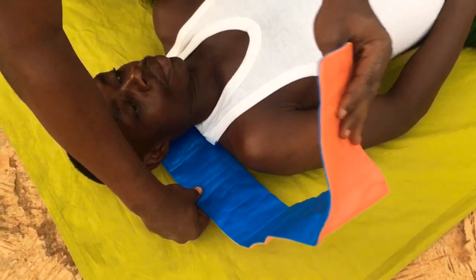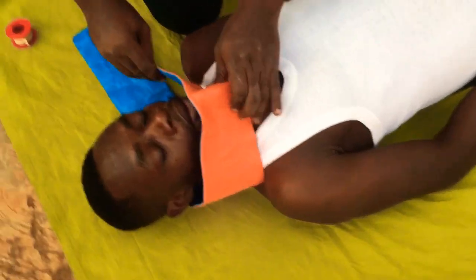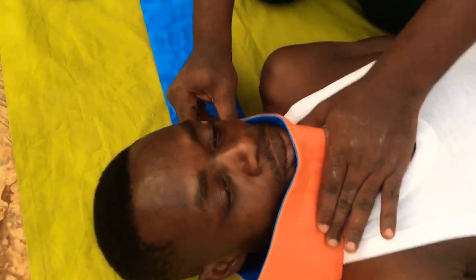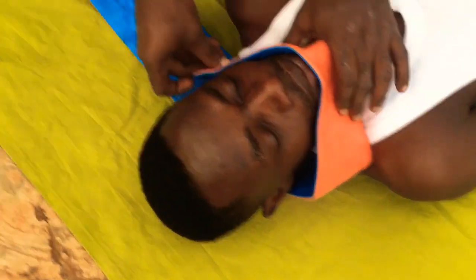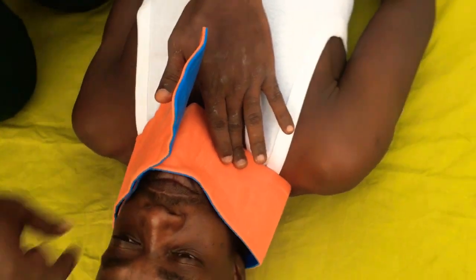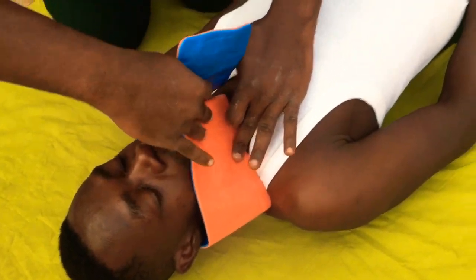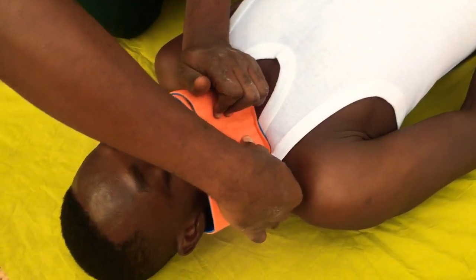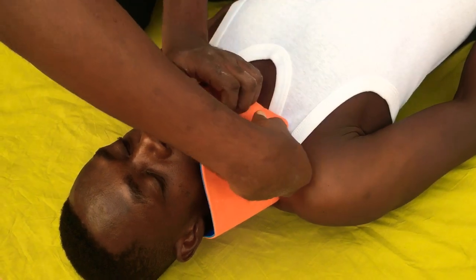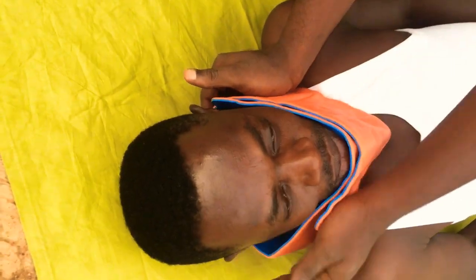When you come to your victim, open the collar and slide this side down, then slide the other side down. Apply it to the neck and leave a space here — we'll look at the purpose of leaving this space. Remember, my partner is still maintaining manual stabilization of the head and neck. Come to this side, turn it and form a shelf that conforms with the curve, making sure it is shaped correctly.